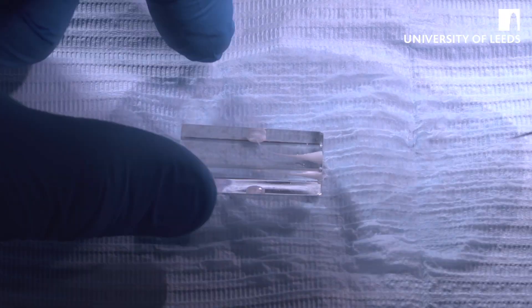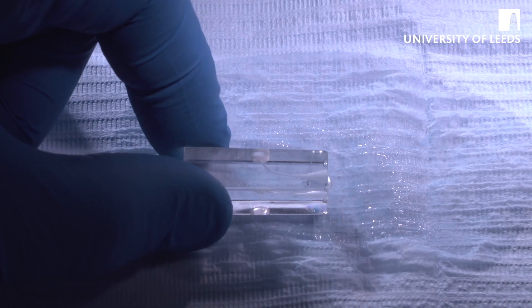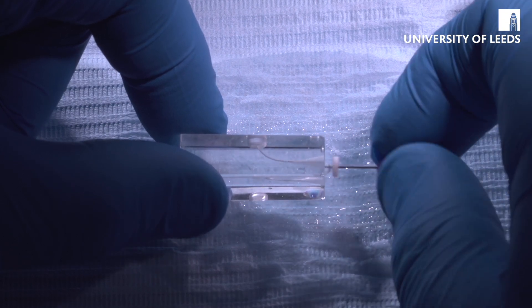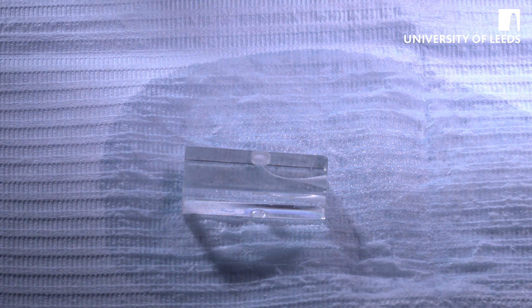After each file that's gone in, we're going to irrigate again. Then we're going to take our size 10 and just clean out any debris — this is known as patency filing. The next thing we're going to do is move on to our Shaper 1 file, the S1 file.